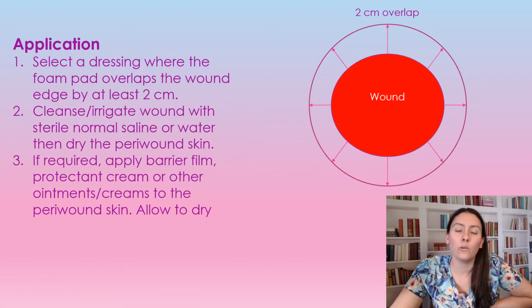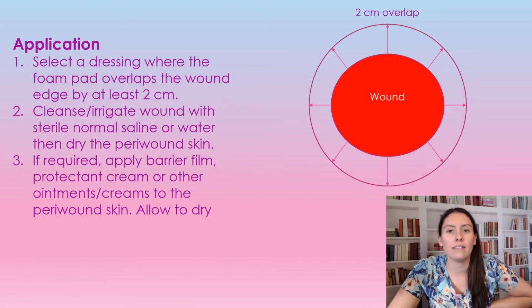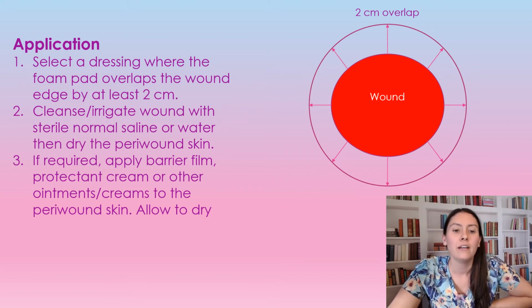So you're going to pick a dressing size that covers the wound and 2 centimeters of the peri-wound. You're going to irrigate the wound, making sure all debris is removed and the peri-wound is cleaned, then dried. If required, you can use a barrier film over the peri-wound.